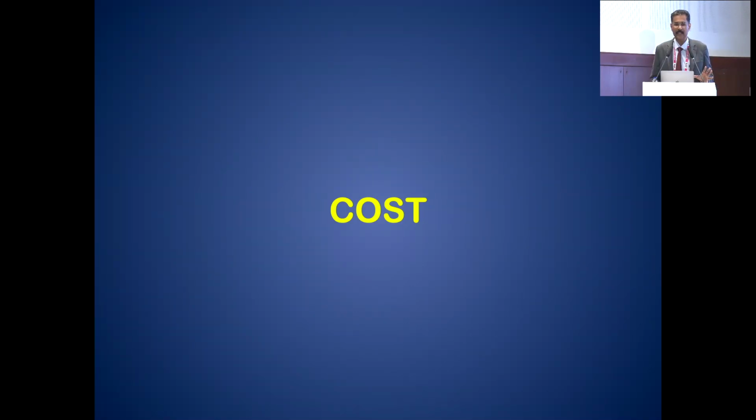And the cost factor is definitely there, and it will be almost double the cost of your premium IOL patient's cataract surgery. That is coming down now, but still it is on the high end. So please choose wisely whether you need this to do a rhexis. But for completion's sake, in a tertiary institute, if patients ask and you don't have laser assisted surgery, then you should be able to offer this. That's why we have it.